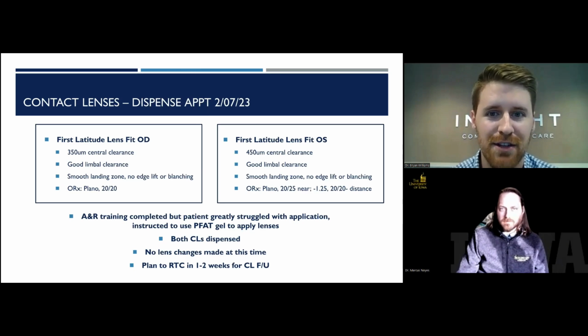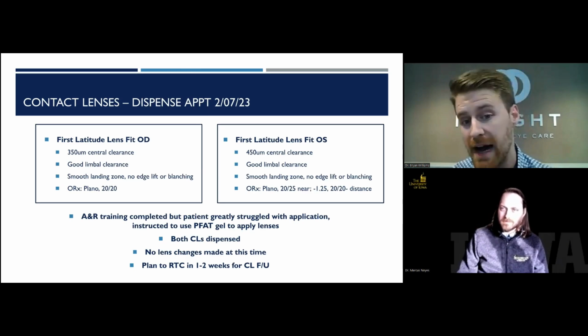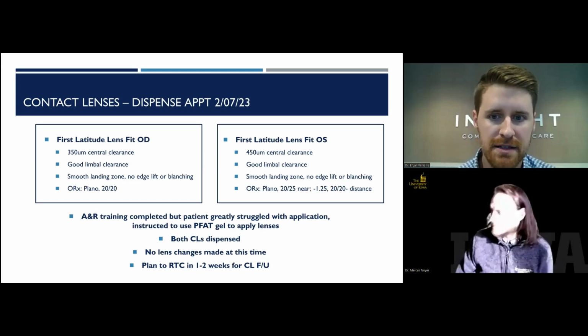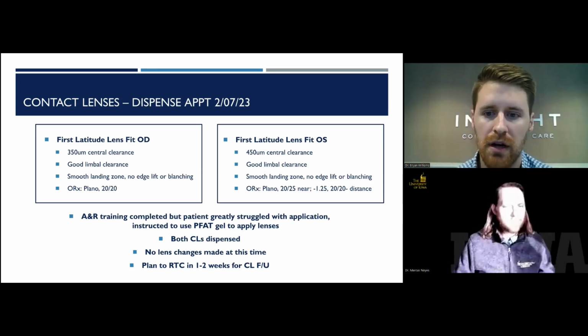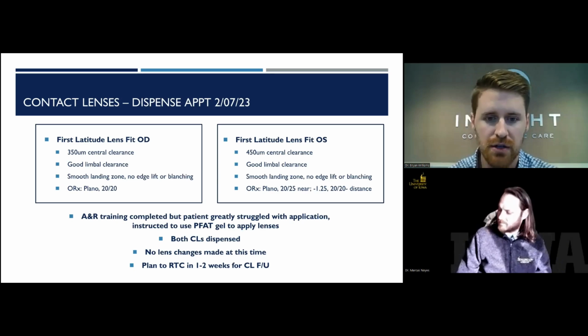So that was a good teaching tool for her, saying really load up on the eye makeup after the lens. Otherwise, you're going to get some gunky lenses and a lot of cloudy tear reservoir. We had that talk and she learned the hard way on this one. But like we said before, initial dispense of this lens, adequate clearance, adequate limbal zone. The landing zone looked like it was in good shape for the most part. Happy with her near vision in that left eye, like we shot for monovision. So we had a pretty good initial result leaving.